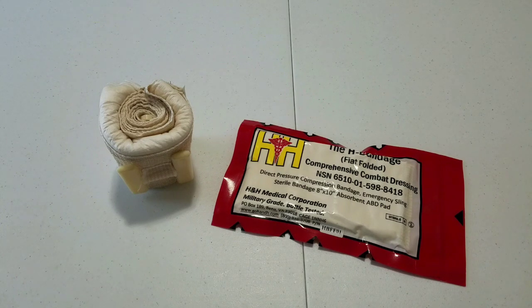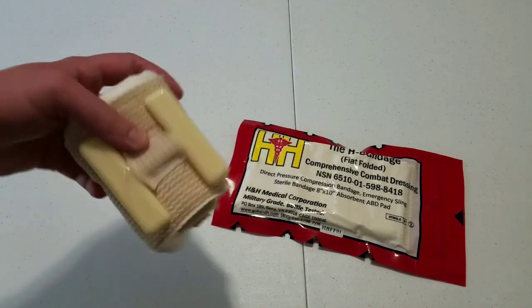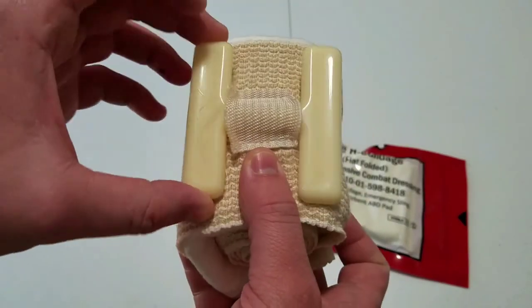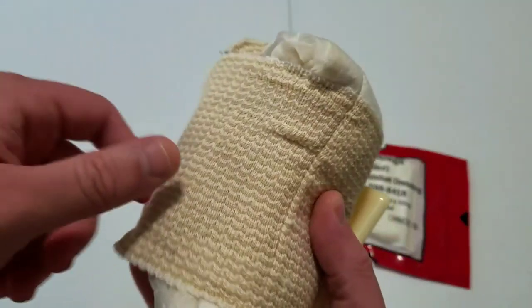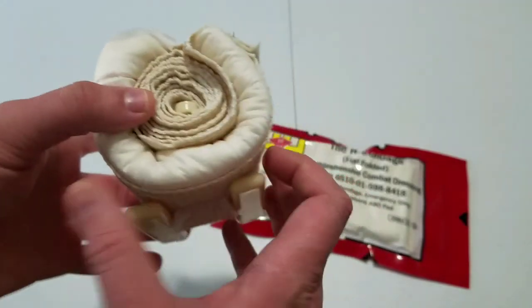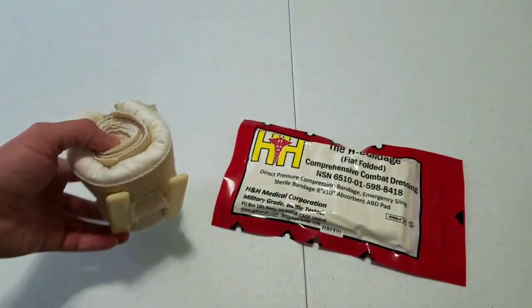It doesn't get the name H Bandage just from the fact that it is made by H&H Medical Corp, but also from the fact that its pressure application bar is in the shape of a letter H. This is an ACE-style elastic wrap with a large blood-absorbing pad on it with an H-shaped pressure application bar.